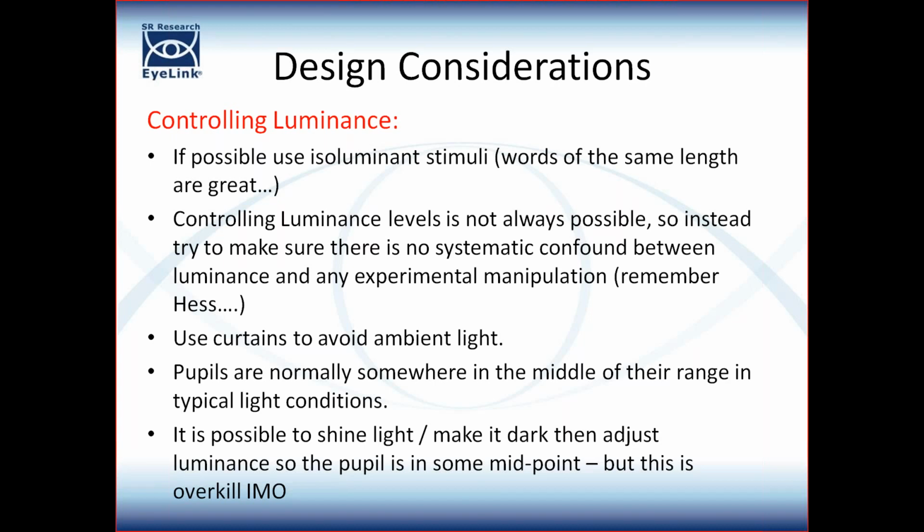So if you have got a load of stimuli, you can very easily load them into MATLAB, and it will just spit out the overall brightness level of the colors in all of the pixels. You can use that as a very rough check to make sure that you've got no gross luminance confounds. So it's not the case that all of your stimuli in the happy condition are brighter than all of the stimuli in the sad condition, because if they were, that would clearly lead you falsely to conclude that people were more aroused to sad faces because they were actually darker, not because they were sad.